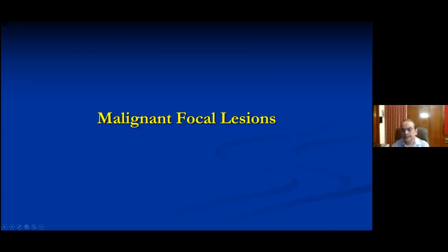A few more related to HCC. And the next one is Jayanta from Calcutta. And he's asking, how can we differentiate capsulated HCC and liver abscesses in a CT scan? I think allow me to go through the spectrum of HCCs, and I'll take this question in the second part, because by the time I would have highlighted the features. And specifically, any indications of image guided biopsies for diagnosing HCC? Or should we ask all the questions related to HCC in the second part of the talk? That may be better, that would be better.